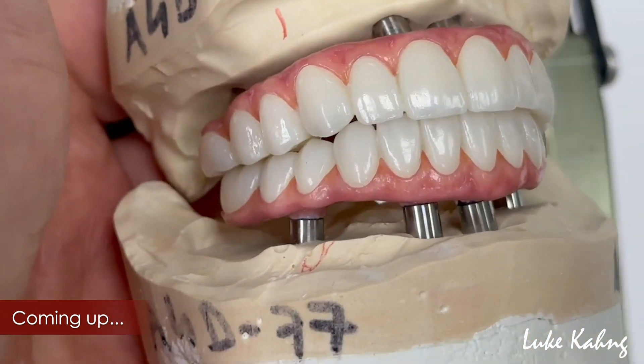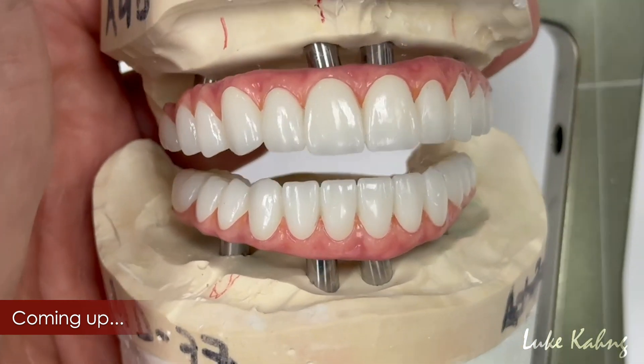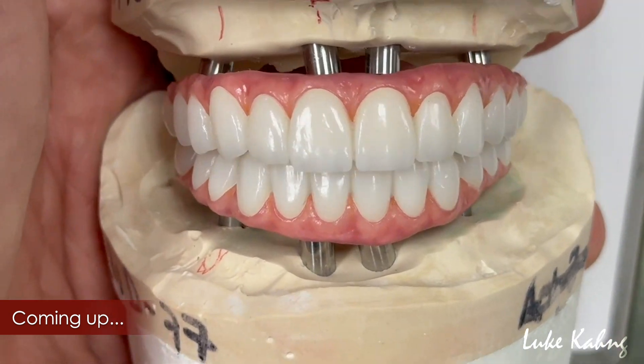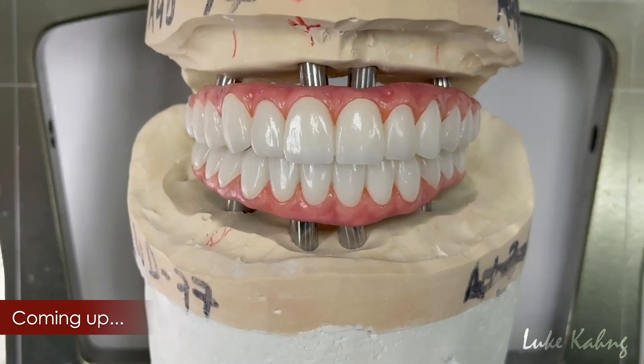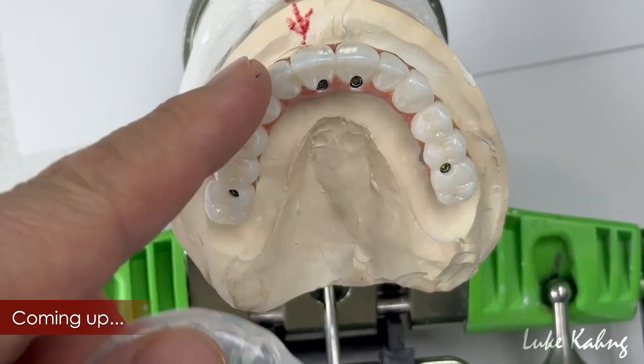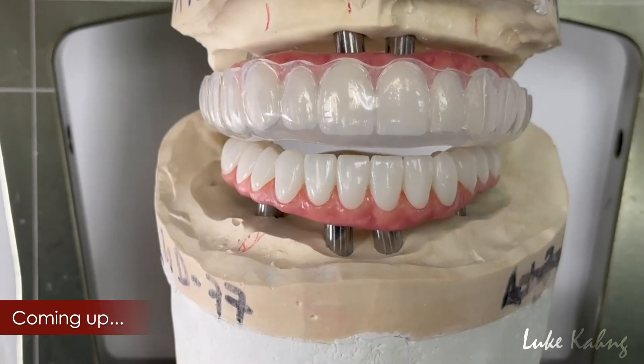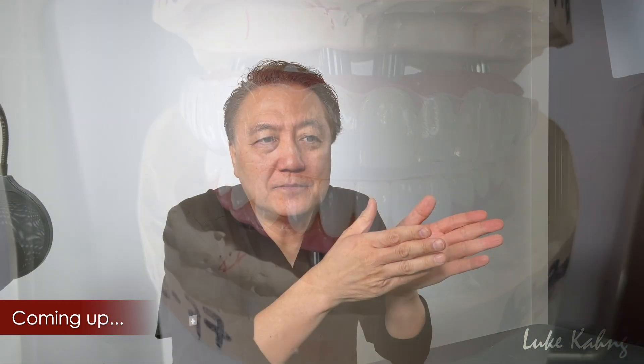This is the last stage. The patient has a denture from extracted teeth. After they wear the denture, so many problems — the repair, the reline, they take it out, put it back. And this is the final destination which they chose, because they are sick of it. All the locator denture and acrylic hybrid denture are a problem. Zirconia they don't like — the top and bottom click sounds are really bad.